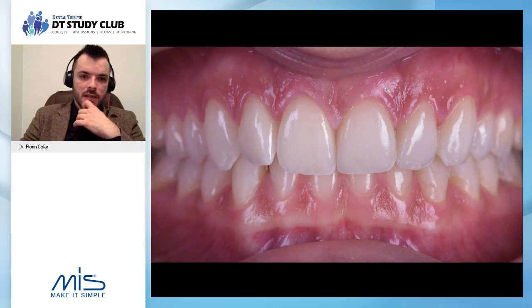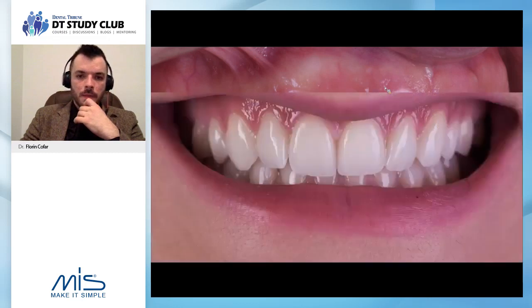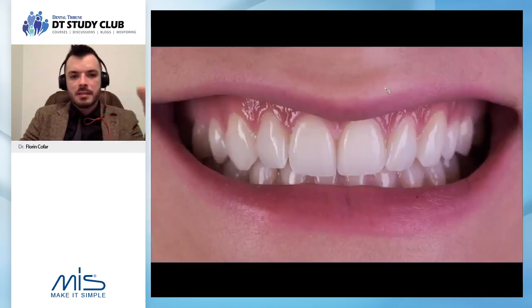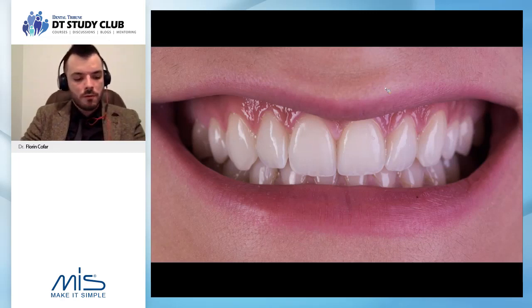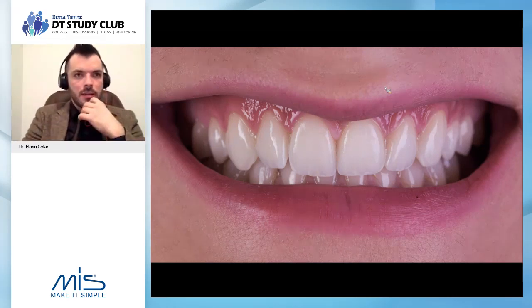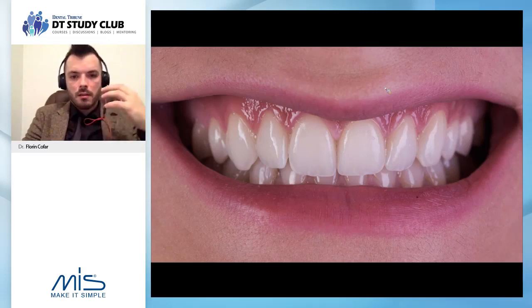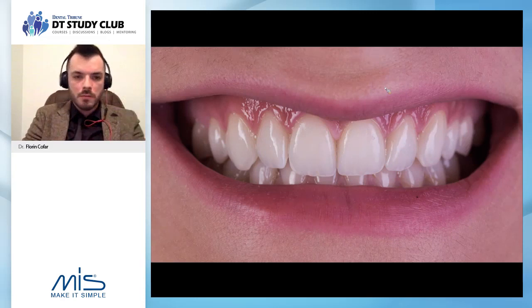As you can see, this is the final ceramics in the mouth, and if you look at the morphology, it's all asymmetric, it's all natural morphology that we copied from a Smile library. So let me say this again, there is no retouching in this kind of workflow. After the restoration comes out of the machine, we're not going to do anything other than polish and stain, because the essence of it is the shape and morphology, which comes from a natural one, which means we don't have a lot to change after.